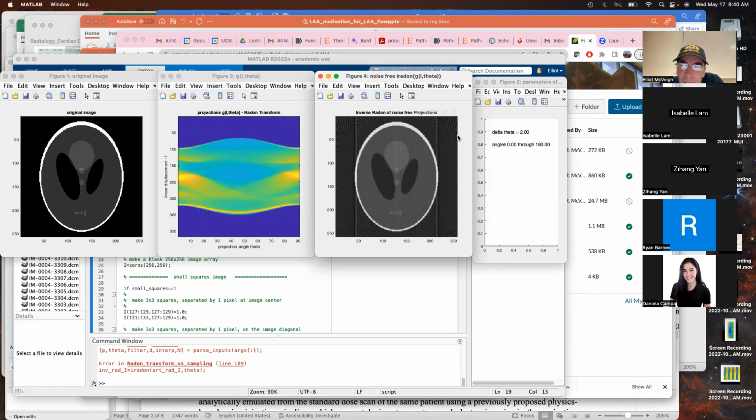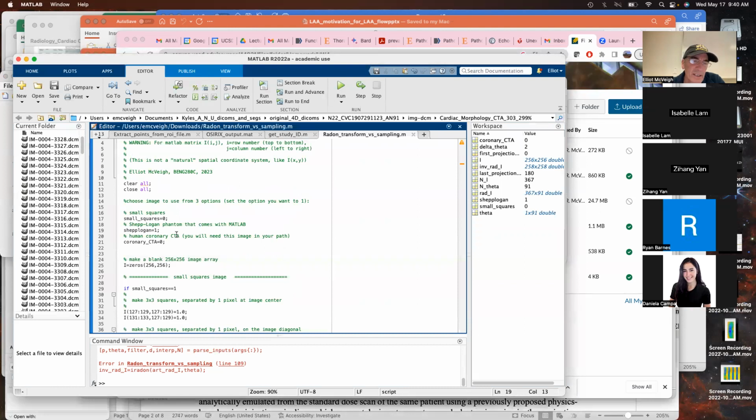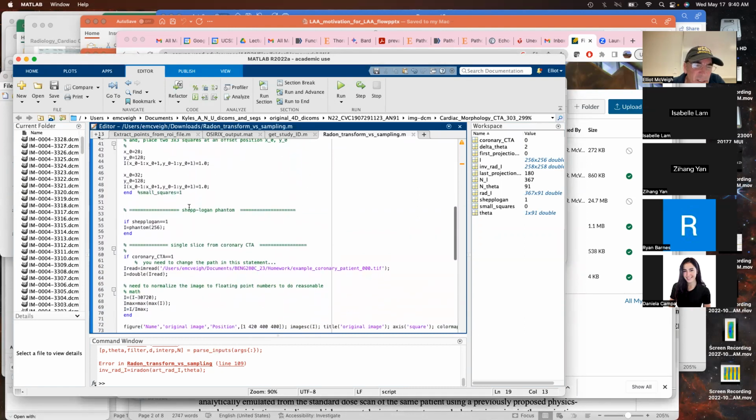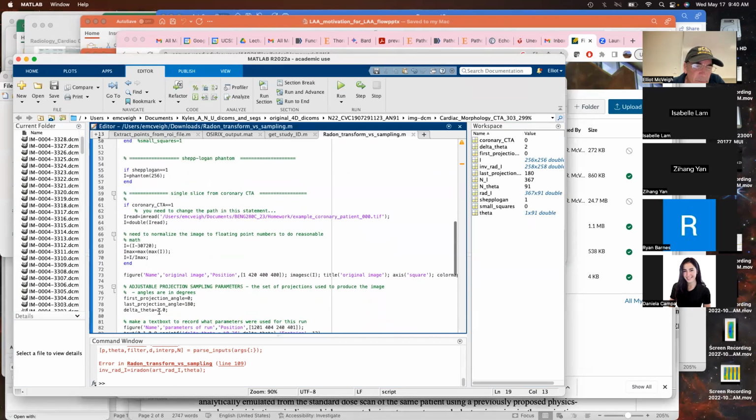So you can see there's some complex artifactual stuff in the background due to the fact that we don't have a high enough sampling rate. So let's change it. Let's go back to 1 degree.